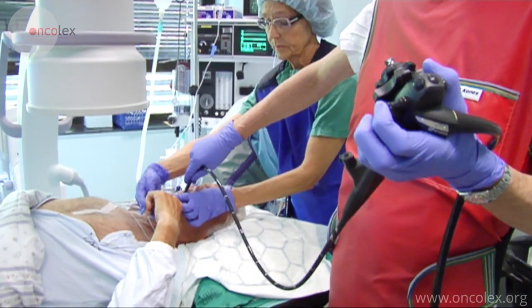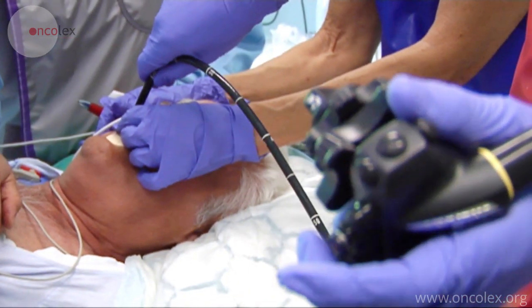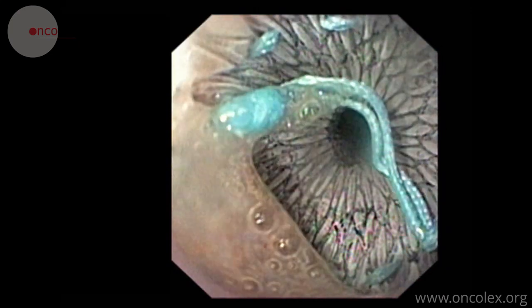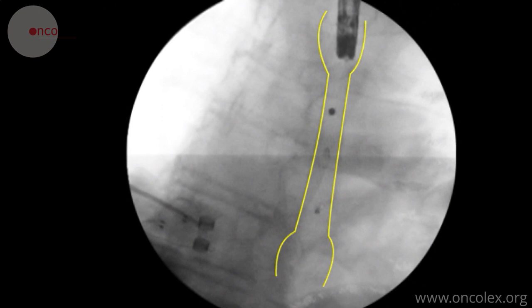The doctor inserts the gastroscope again to check that the stent is placed correctly. Here we see the stent in place in the esophagus.